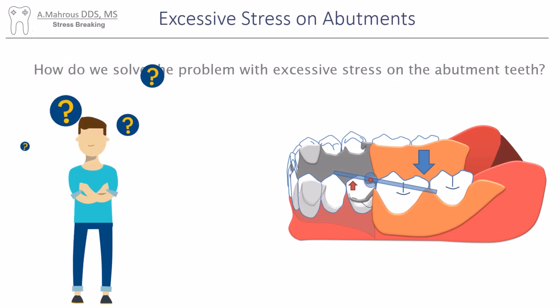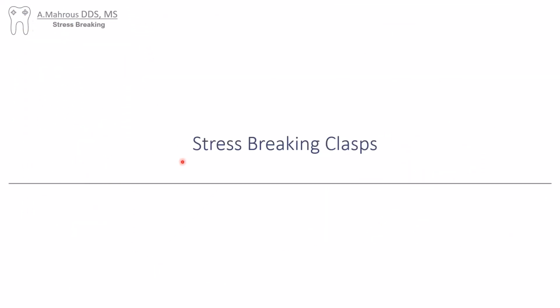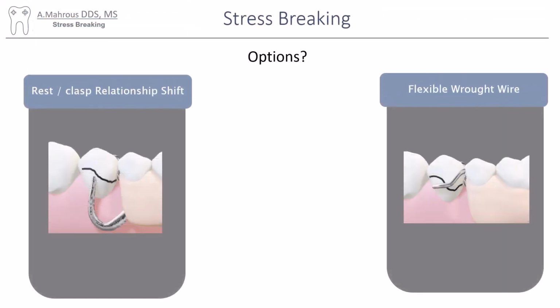So how do we solve this problem? Stress breaking clasps. There are two options here. Either we change the rest-clasp relationship, or we just use flexible clasps.